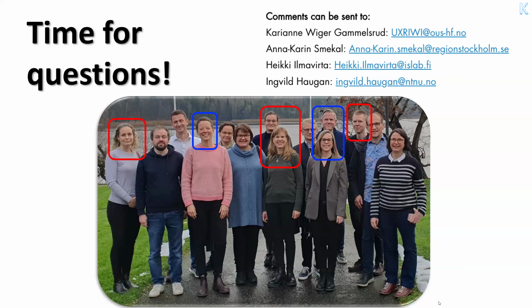Can ECOFF be shown in the breakpoint table for the noted antibiotics? Potentially, yes, but there are some problems with this, and one of them is that the ECOFFs can still sometimes be revised, and this can lead to a discord between what is in the MIC distribution website and what is in the table.